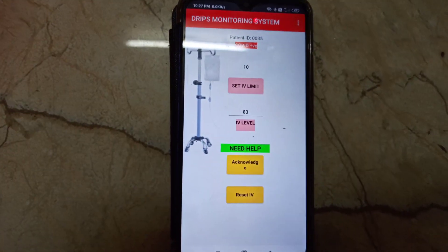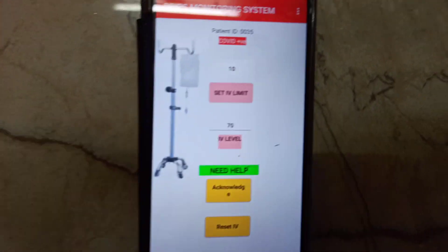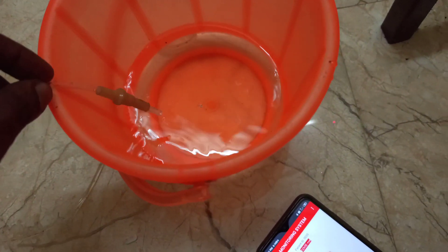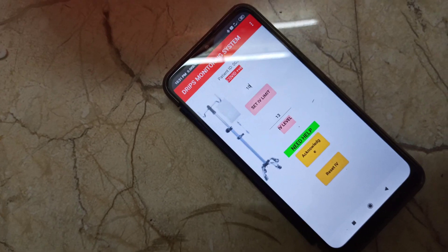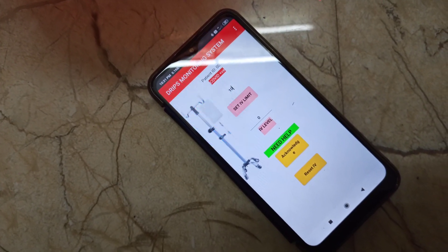Now it is 83% and I have set the alert threshold to 10%. Glucose is reducing slowly. Now it has reduced to 13%. That's all — we got the alert.